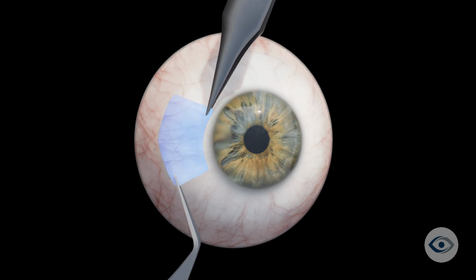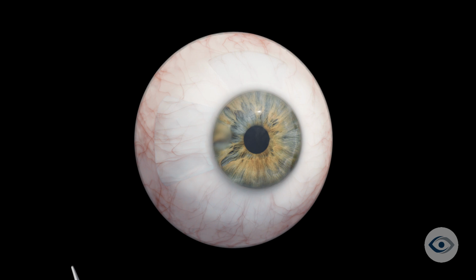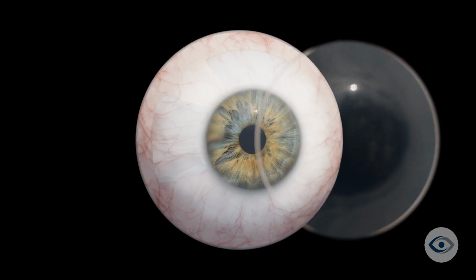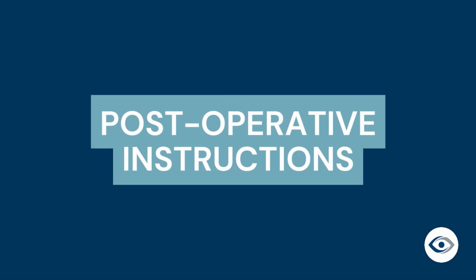In certain scenarios, your physician may use an alternative type of tissue to close the defect and will discuss this with you beforehand. A faint haze may remain within the cornea after surgery due to the presence of the original pterygium. However, this is usually visually insignificant. To help with healing of the corneal surface, a bandage contact lens will be placed on your eye. This is typically removed in the office after approximately 1 week.